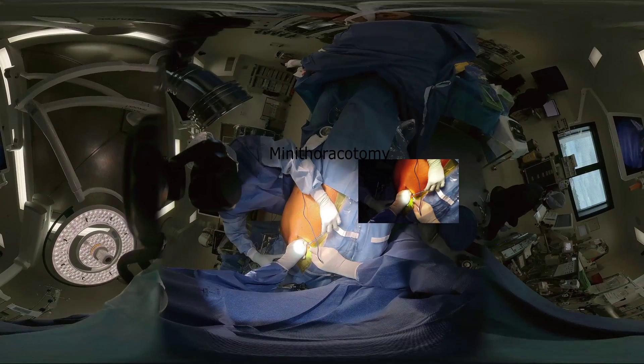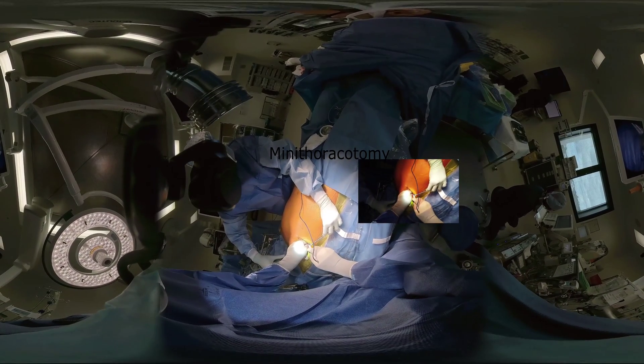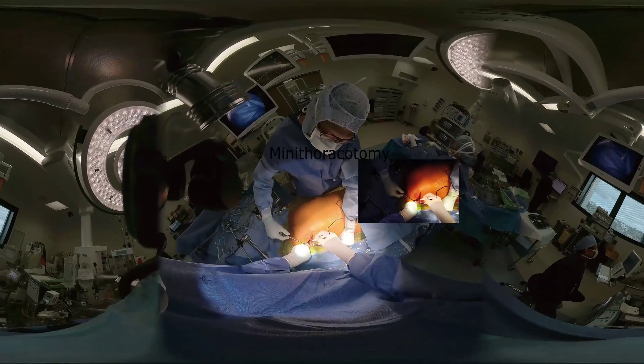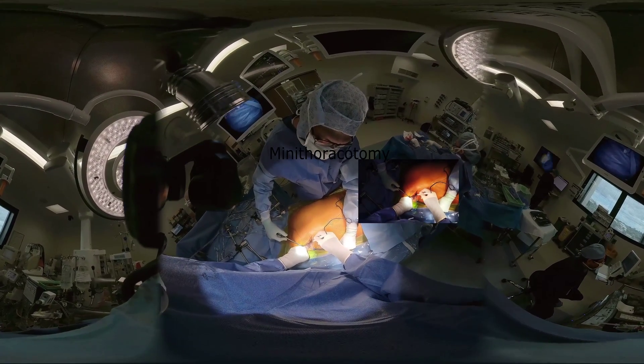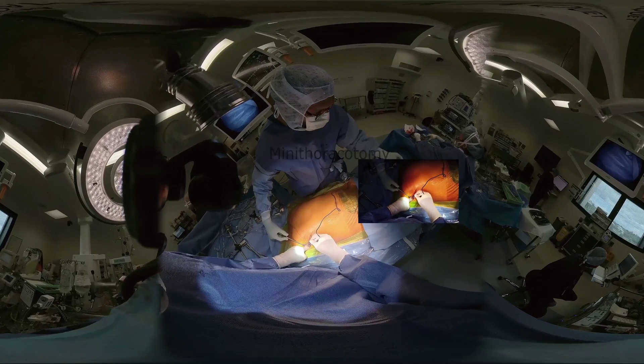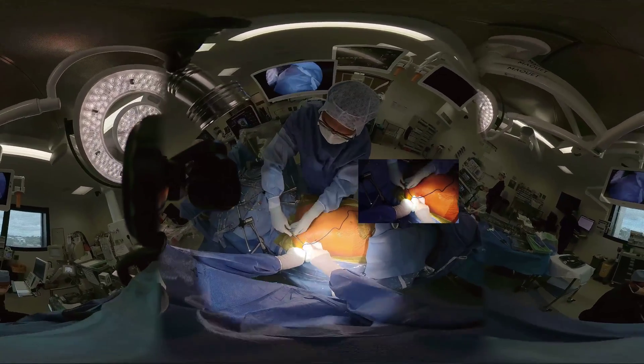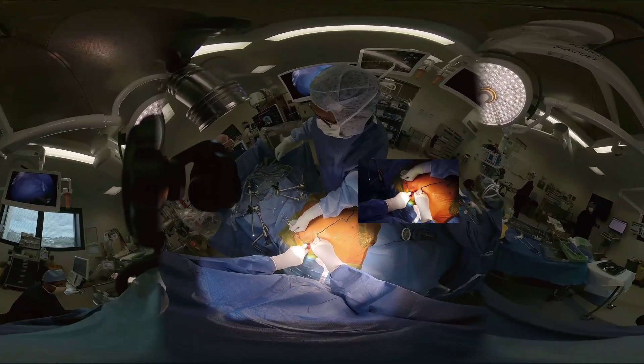A 4 to 6 cm right submammary incision is made to enter the third or fourth intercostal space. A preoperative chest x-ray helps delineate the height of the diaphragm and assess the correct intercostal space. In females, following the submammary incision, the space can be easily found by migrating up to the correct intercostal space.